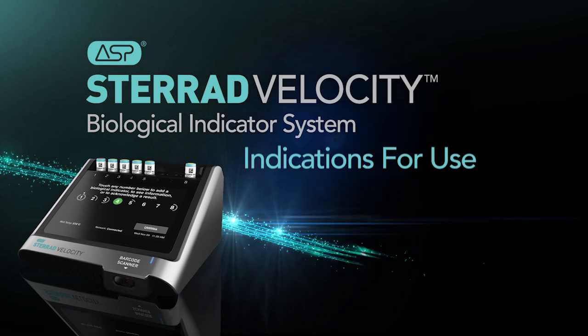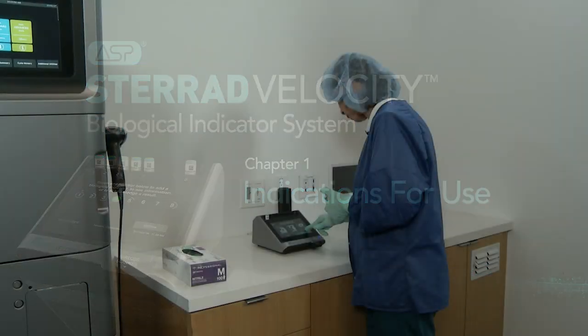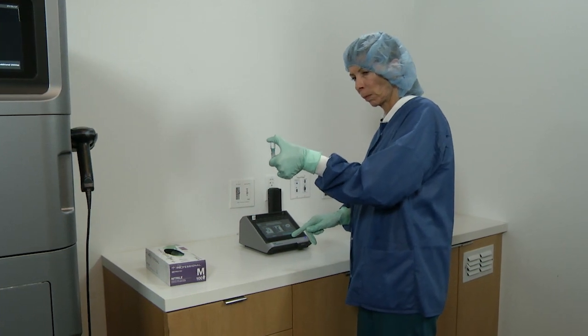It's important to identify the indications for use of the STERAD Velocity Biological Indicator, or BI, in conjunction with the STERAD Velocity Reader.